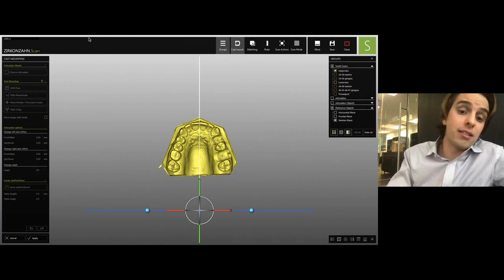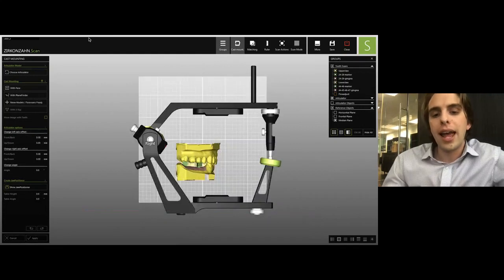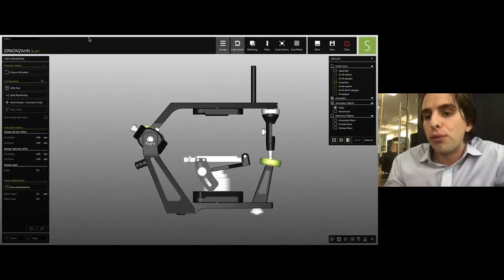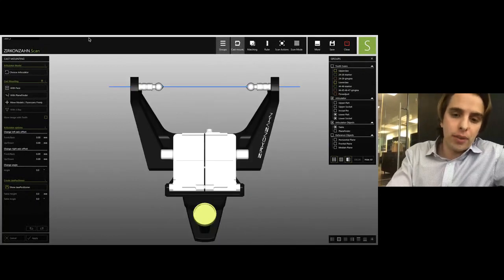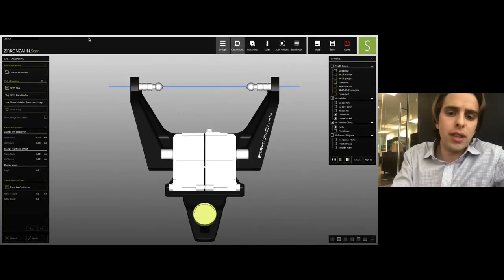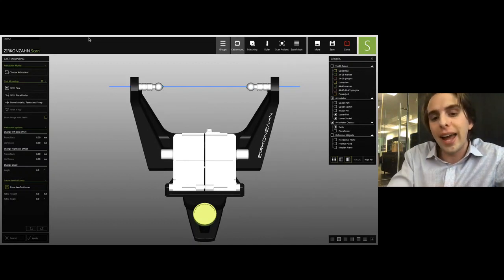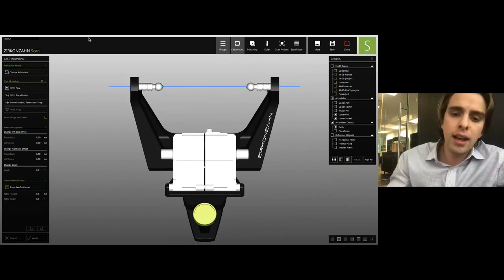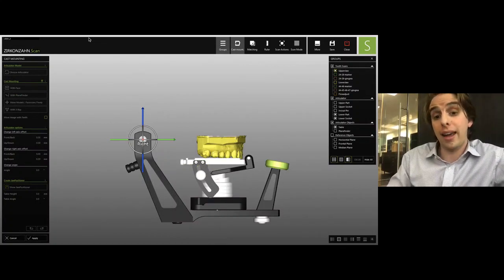We align the skeletal midline of this maxilla to that median plane, and then we load this beautiful mounting table called plane positioner, which gives us an indication of the center of occlusion, which is that x-axis running along the plane, and we go to position the center of occlusion so it intersects with that x-axis on the plane positioner.